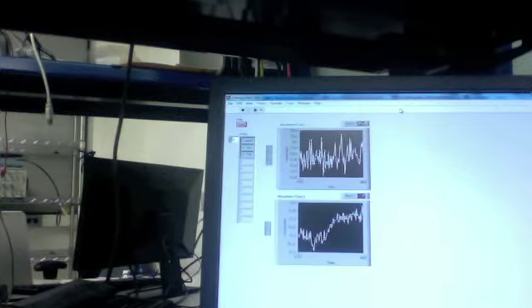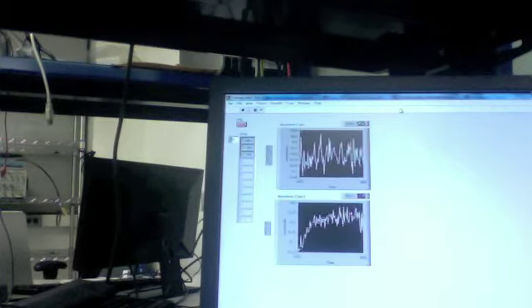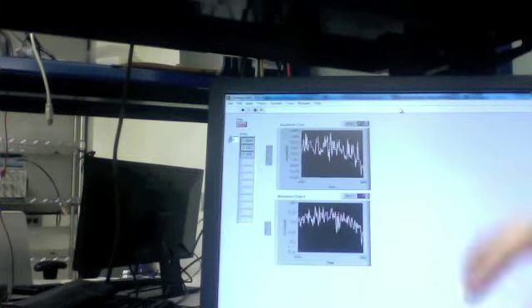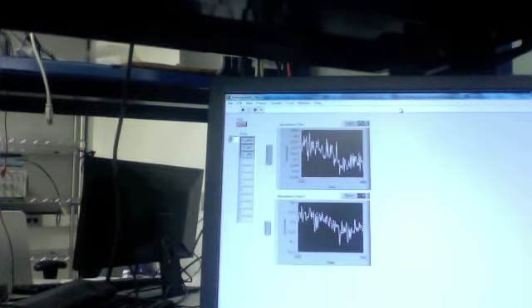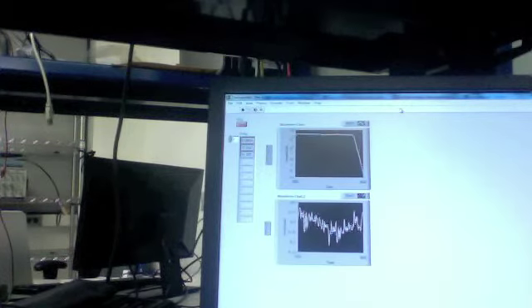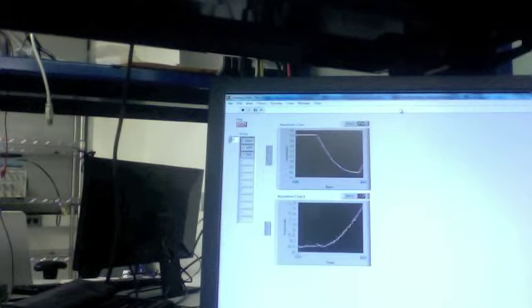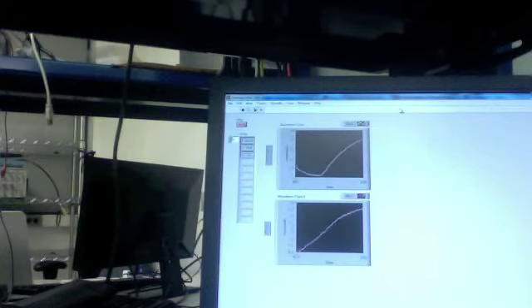Now that our circuit has been all hooked up and our thermistor is attached to the output, let's take a look at this waveform chart that demonstrates the live cooling cycle. Okay, cooling is being activated. Okay, activation begin. So as you can see, the cold side has drastically decreased in temperature, while the hot side, the graph on the bottom, is continuing to increase, which is as expected.